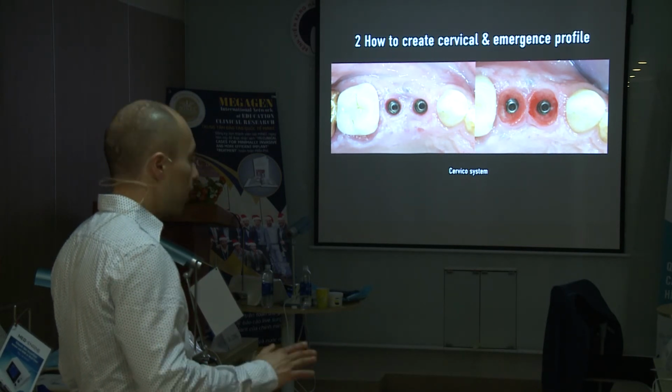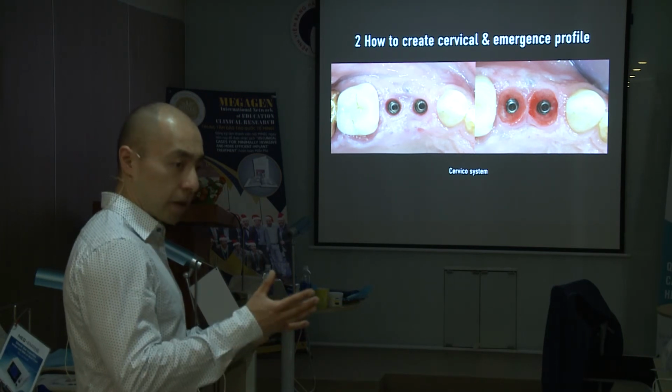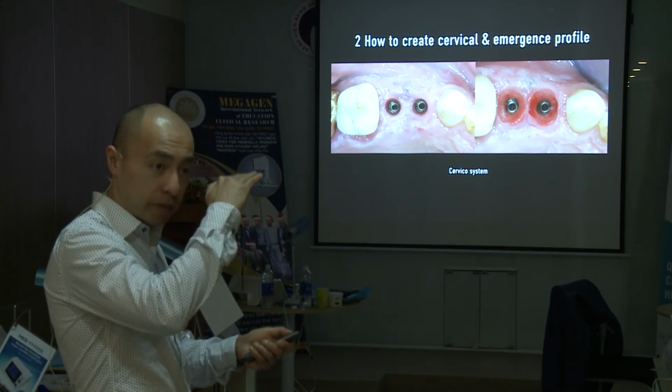So these are making some kind of half crown, a half temporary crown, not the upper part but just the lower part.